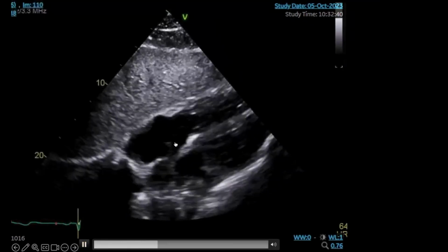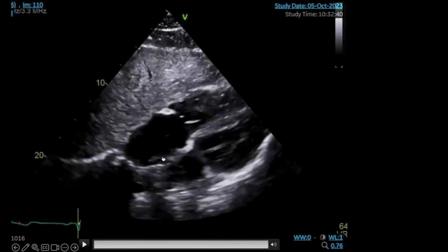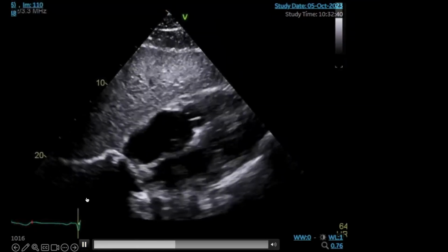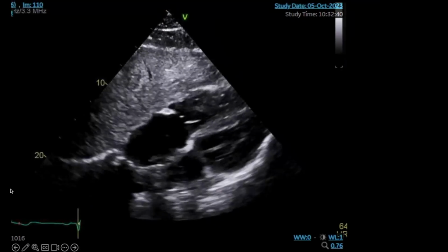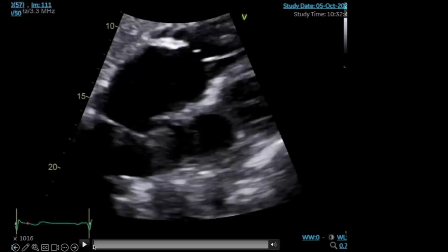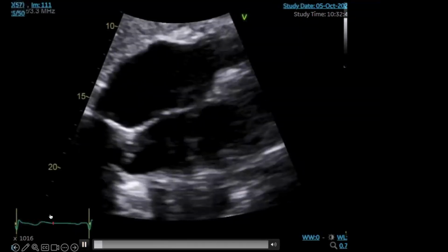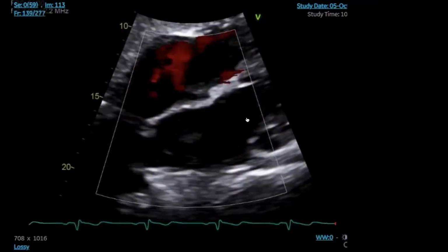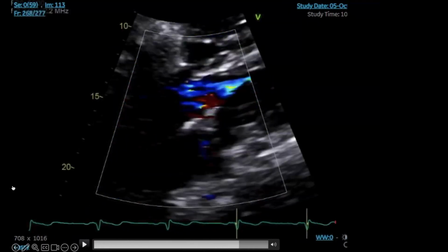And then when we're looking at our subcostal view, this is where we're seeing our interatrial septum, and we really don't see a lot of dropout there. There's no clear indication that there's a defect, but again, we have a dilated coronary sinus, as well as some dilated RV structures for no other specific reason. If you looked at the full study, as we interrogate that more, still no defects. And with color Doppler, we don't see much hint of any turbulent flow or shunting across the interatrial septum.